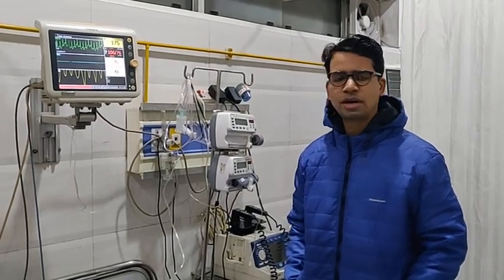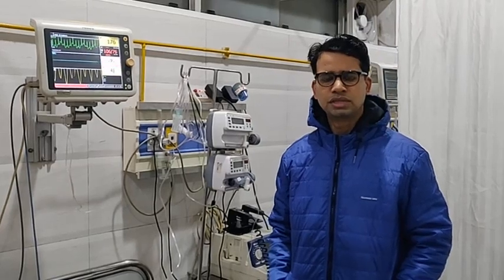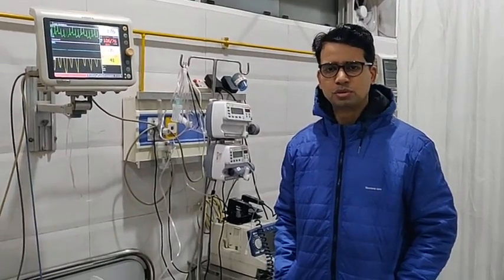He is presently on noradrenaline. So we are planning to give him a cardioversion with a DC shock of around 200 joules.